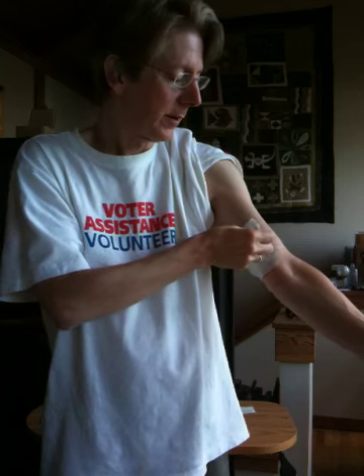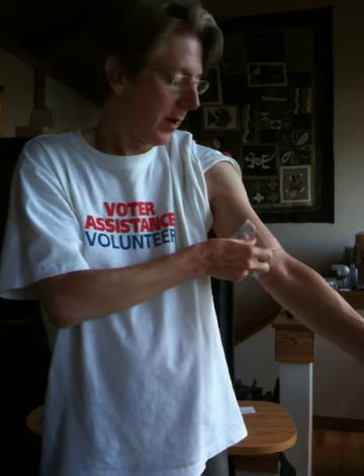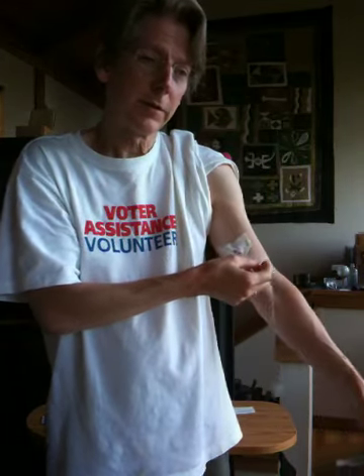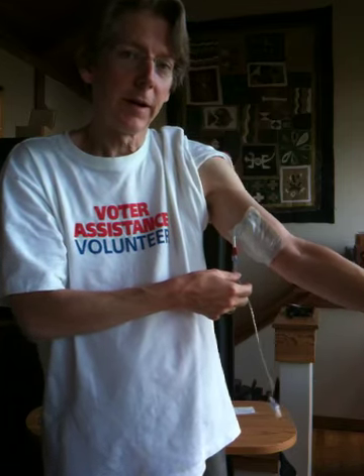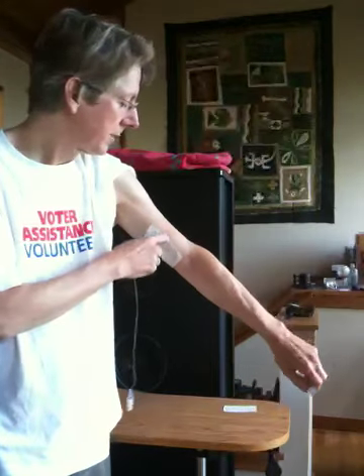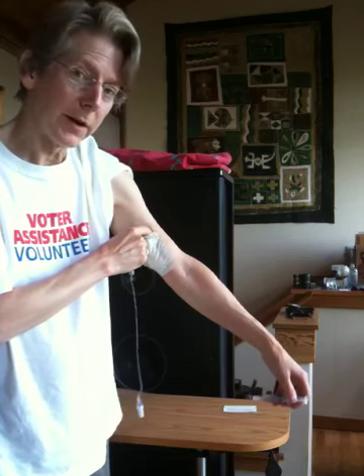It's for delivery of antibiotics for Lyme disease. I'm Bob Cowart, by the way. Today, after six months of using different kinds of antibiotics, we're going to take out the line — I'm going to remove it, and that's going to be a great thrill.